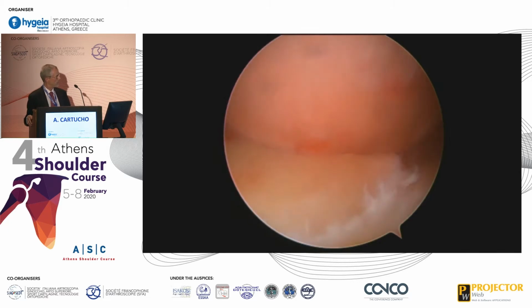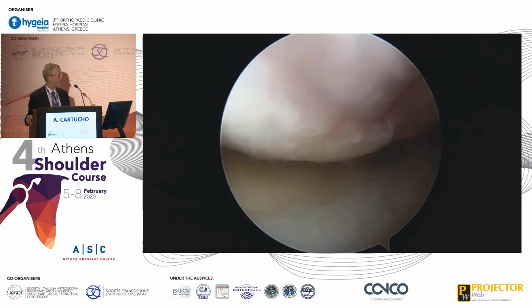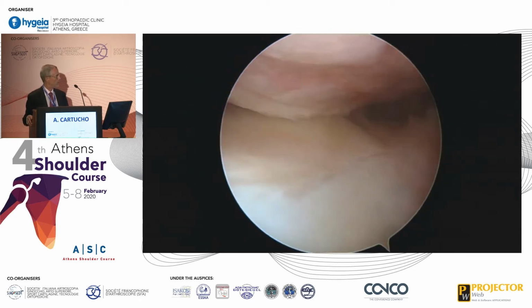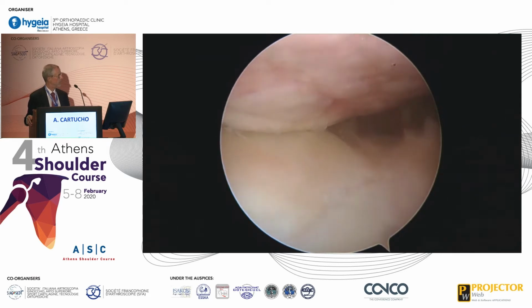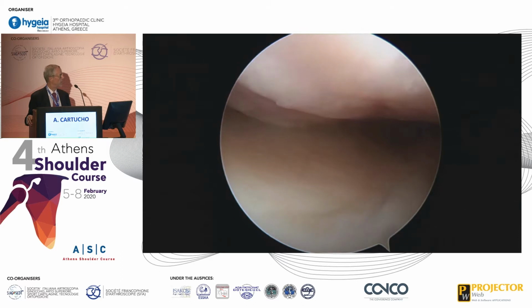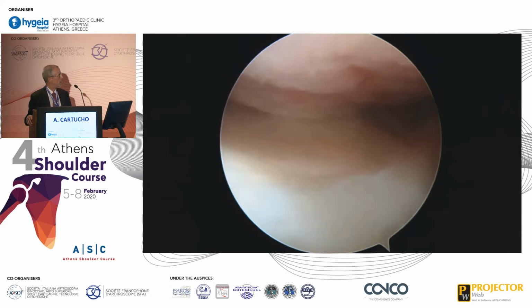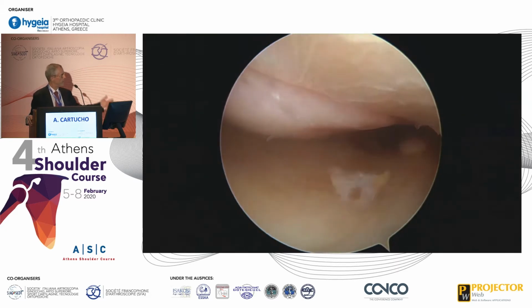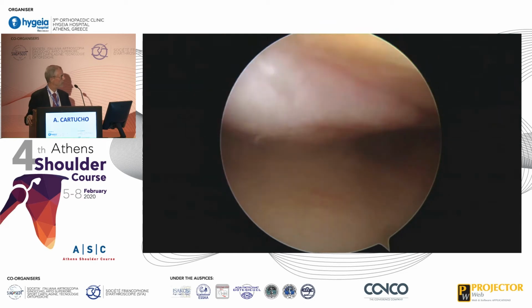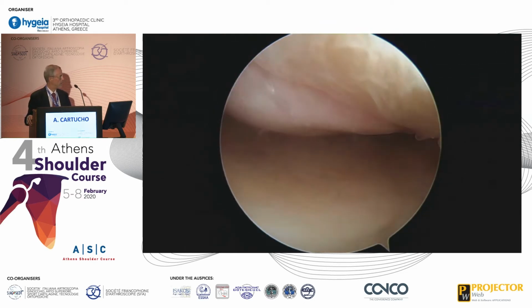If I see this, which is an off-track lesion engaging, for me it's a bone block procedure, so I don't proceed with remplissage. If it is like that, which is non-engaging during the arthroscopic, a non-engaging Hill-Sachs lesion, then I will consider a remplissage in this patient. And we'll go from here, and now I will explain to you how I do my remplissage procedure.